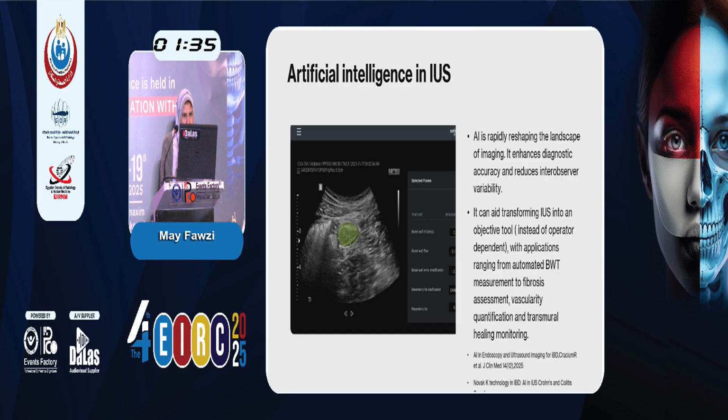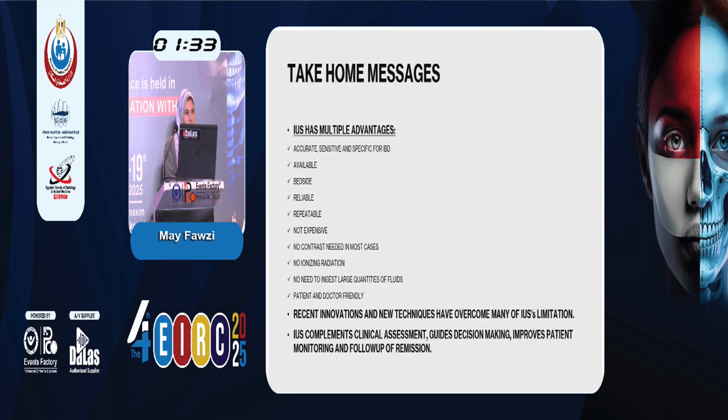Very interesting. So my take-home message is IUS has multiple advantages. Its recent innovations and new techniques have overcome many of its limitations. IUS complements clinical assessment, guides decision-making, improves patient monitoring and follow-up of remission. And thank you very much.